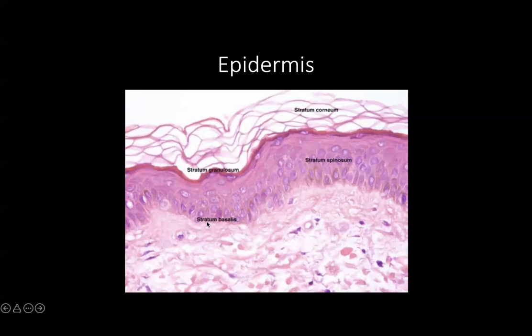And so, how do you know what a melanocyte is? Here you see this kind of paler cell with a little bit of a grayish nuclei. It's going to be your melanocyte. It marks with Melan-A for a cytoplasmic stain and SOX10 for a nuclear stain. It lacks desmosomes as well. And one melanocyte is occurring as you go along the basement membrane for approximately every 10 keratinocytes.